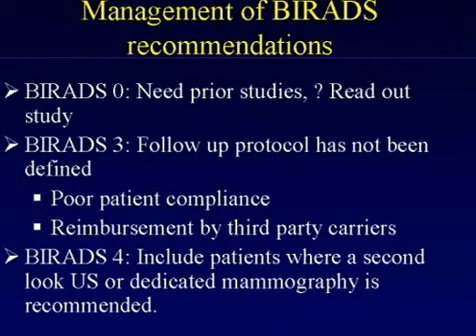BIRADS 3, this is short of a follow-up. No one has really established what is the appropriate protocol. We've adopted a protocol that we use in mammography and ultrasound. So we have patients come back every 6 months for a total of 2 years. And then if that finding is unchanged, we consider it to be benign. However, the patient compliance is poor. Our internal audit shows that only 17% of patients placed in this category actually completed this follow-up protocol. And I think a big issue is that there's problems of reimbursement by insurance. Insurance isn't going to pay for it, the patients are not going to come back.